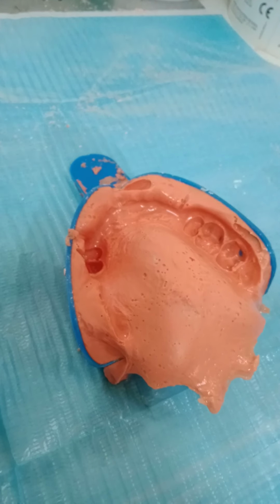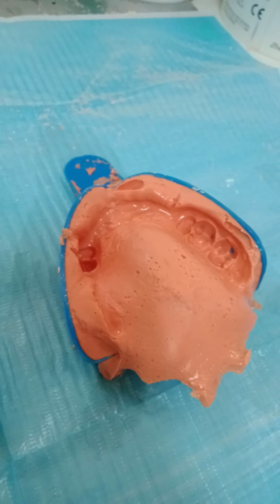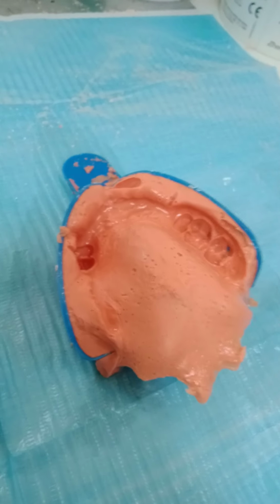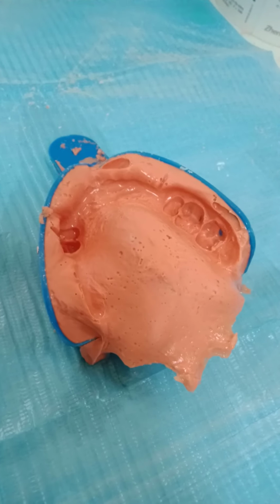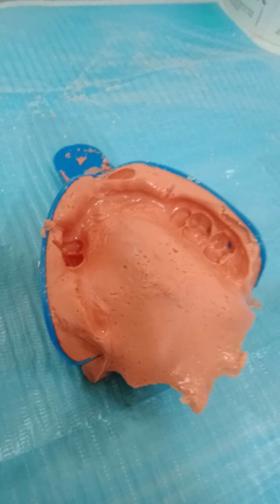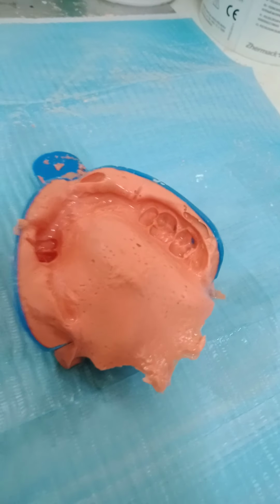Either by making the patient wash his mouth forcefully and gurgle, moving the water around in the mouth with the tongue and wiping it with the tongue, or before taking the impression, I take a small gauze and wipe it away. In some elderly patients, I could even see the saliva. It's like small pebbles in place, made of mucin. So even when they wash their mouth, it doesn't go away. It's heavy, it's thick. So I need to make them wash and swish with the water in their mouth, and then I can even come with a gauze and remove them.